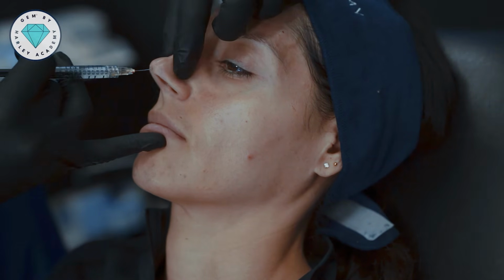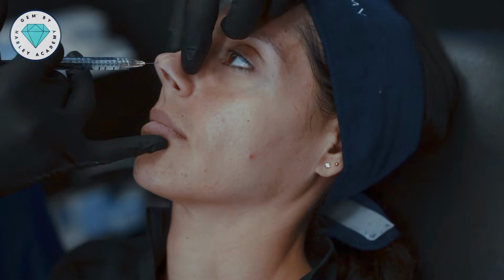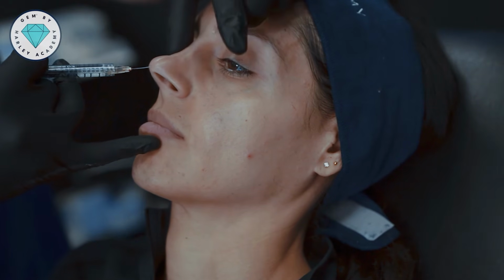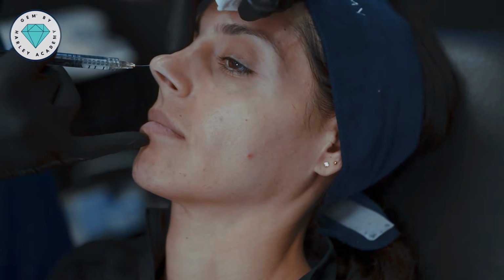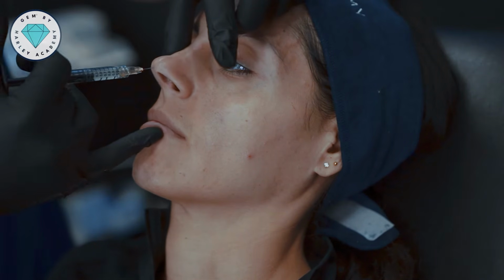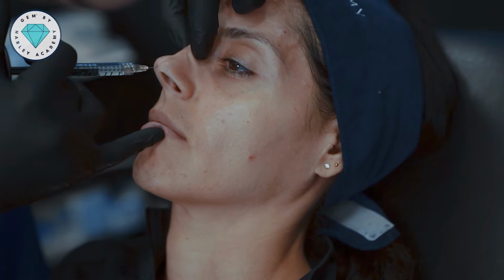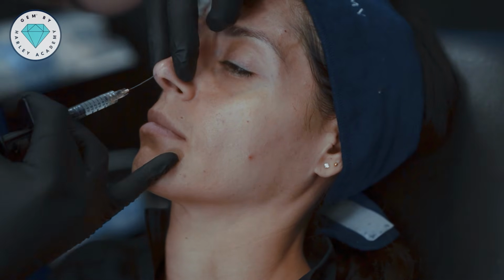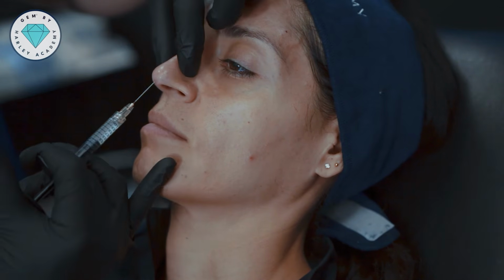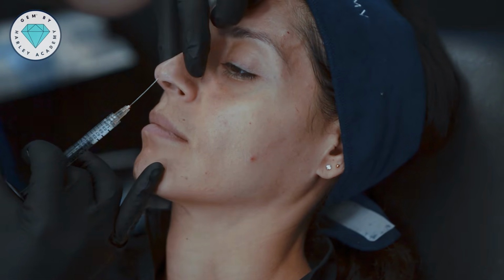And so it's hard for me to say that cannulas are safer, even though they feel theoretically and conceptually safer. I suppose the benefit of the cannula aesthetically is that because you get less soft tissue swelling than you would with the needle, you can see your results a little bit better as you go. That's true. That's correct.